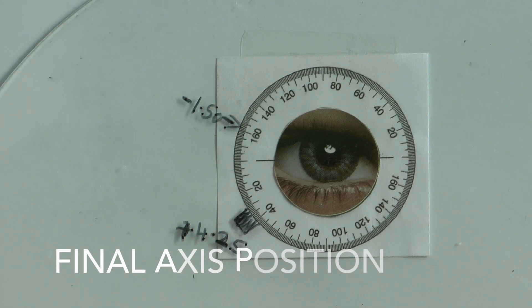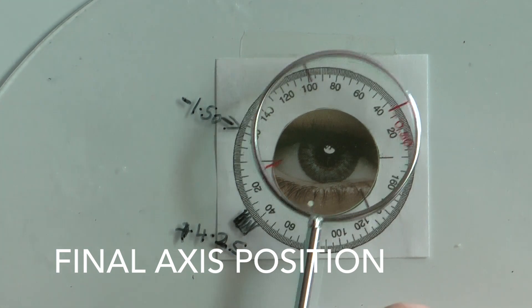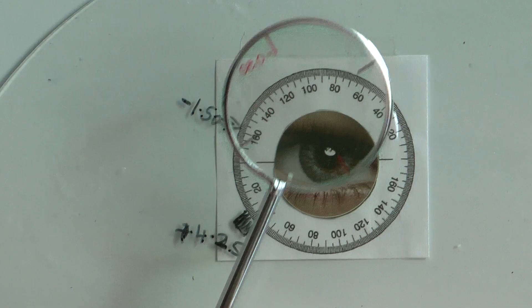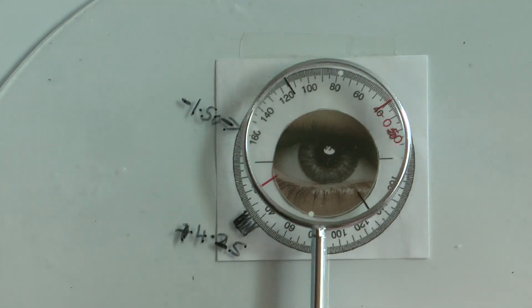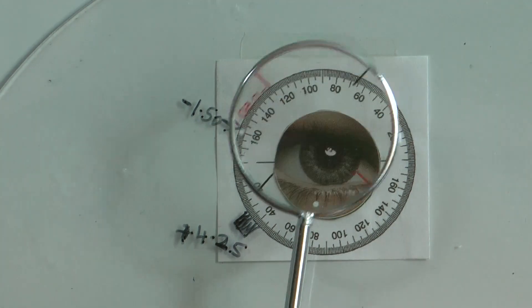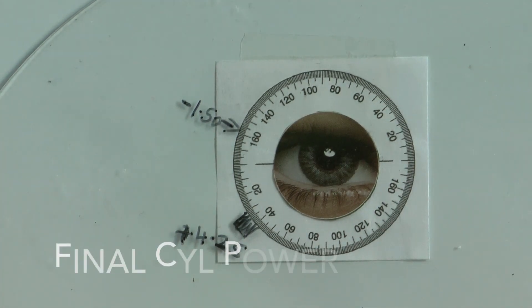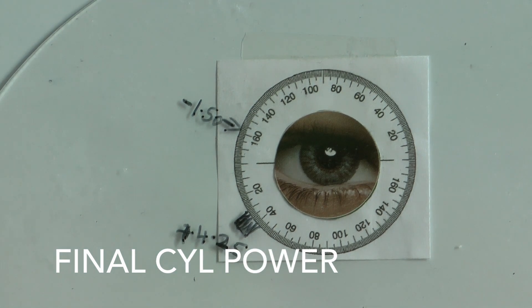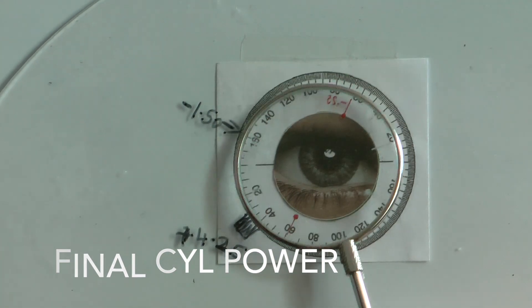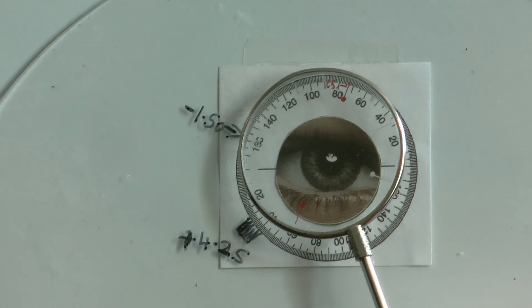You know that you've arrived at the correct cylinder axis when the patient does not discern any difference between one position and another. When you ask is position one better or position two and they say they can see no difference, you know that is the best axis position for them — you cannot improve it either way. In the same way with power, when you're doing fine-tuning with the 0.25 cross cylinder and they say there's no difference between the two, you know you've arrived at the correct cylindrical power, and you just leave it alone.